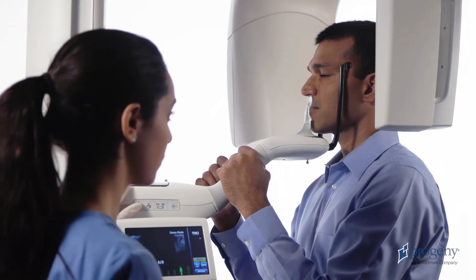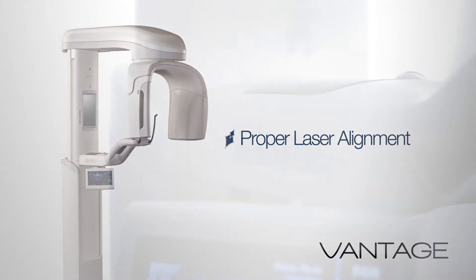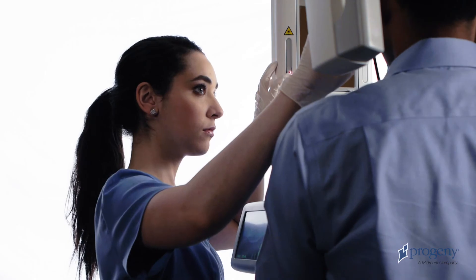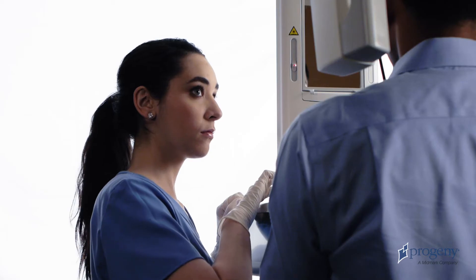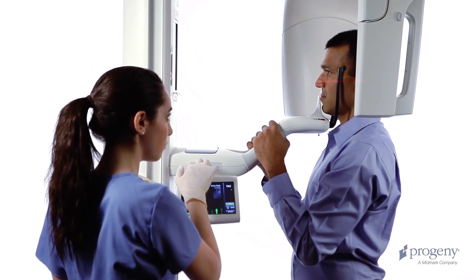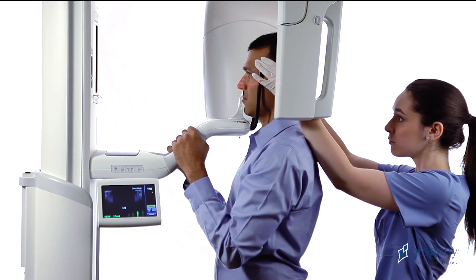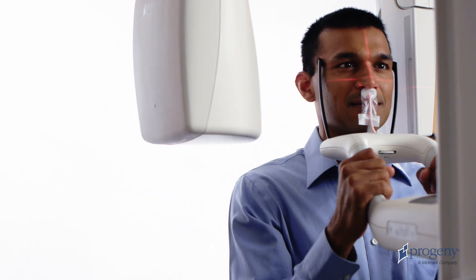Ask the patient to now stand at full height and relax the shoulders. Adjust the Frankfurt plane laser to align with the base of the patient's orbit and the top of the ear canal. After the Frankfurt laser has been set, use the height of the positioning table to tilt the patient's chin higher or lower to bring the Frankfurt plane horizontal. Move directly behind the patient and gently rotate their head to align with the projected mid-sagittal laser. Be sure to observe alignment from front to back as well as from top to bottom.